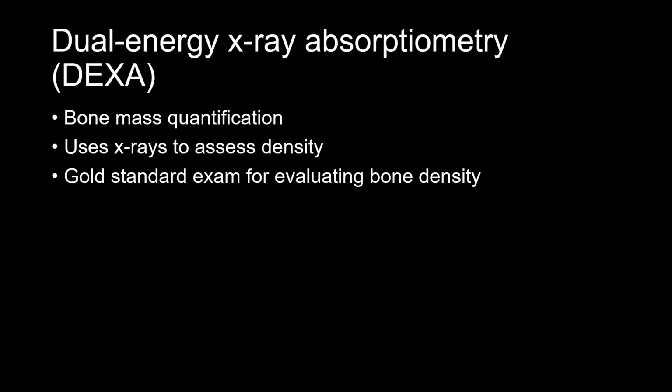DEXA, or dual energy X-ray absorptiometry, is used to determine the density of the bone. So if you're concerned about a patient having osteoporosis or osteopenia, you can use DEXA to get an idea of what level of bone mineralization or bone density they have.